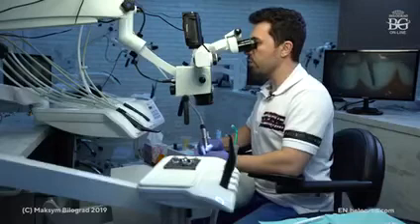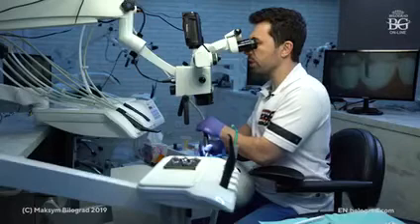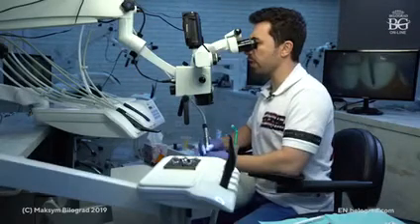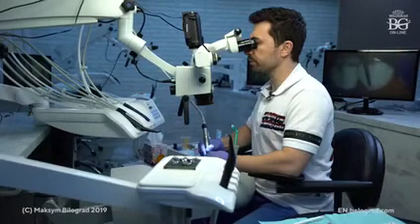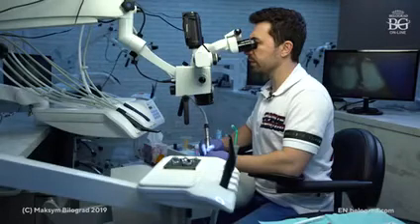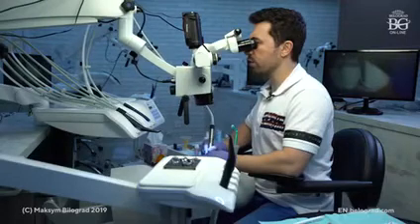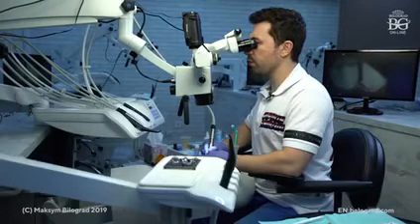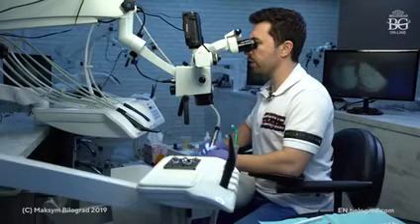Okay, so yes, high magnification, 50-60,000 RPM, red diamond, burr number 14, tip is 0.6, half of the tip is 0.3, and I will start to make my finish line, to reposition the finish line. Okay, so we move it a little bit, more water. During this stage, the assistant helps us with air spray. So we move our finish line a little bit down. I'm working with half of the burr. Again, you see what happens here in the distal. I turn my burr, and you can see how half of the tip is working.